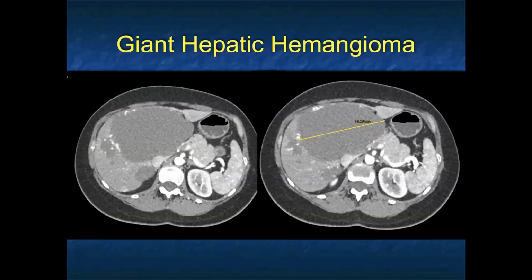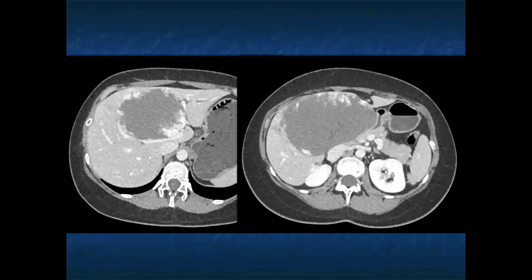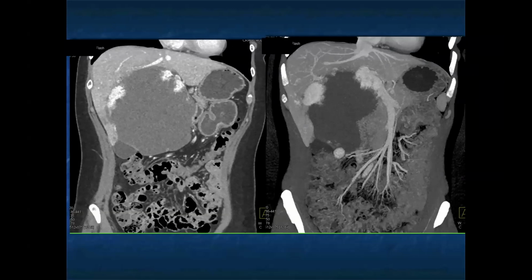Here's another patient, giant hemangioma, all of 13.3 centimeters. There's additional hemangiomas next to them. Hemangiomas are often multiple. Again, you see very nicely as we go from 30 to 60 seconds, the very rapid peripheral puddling, and the lesion begins to fill in over time. And here it is on the volume display. Again, the puddling, that kind of whiskering around the lesion.